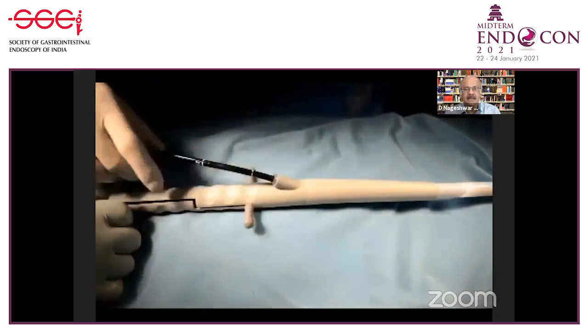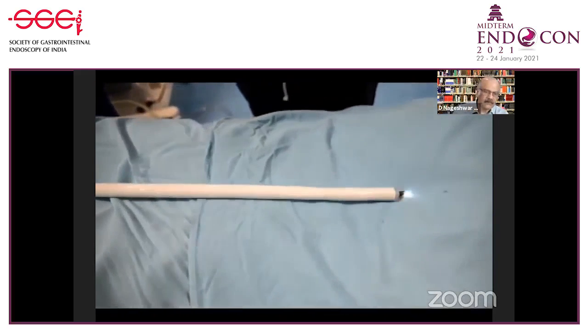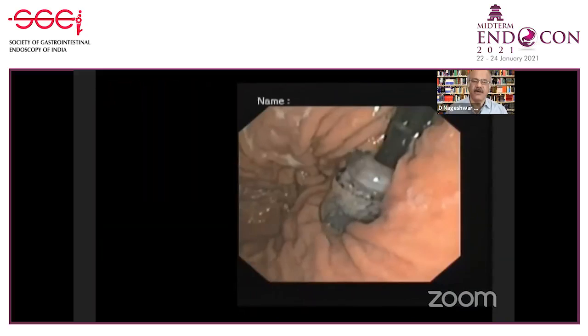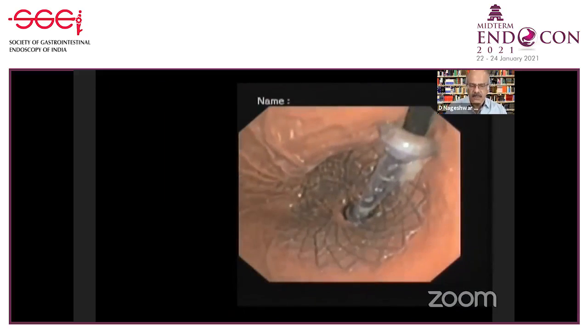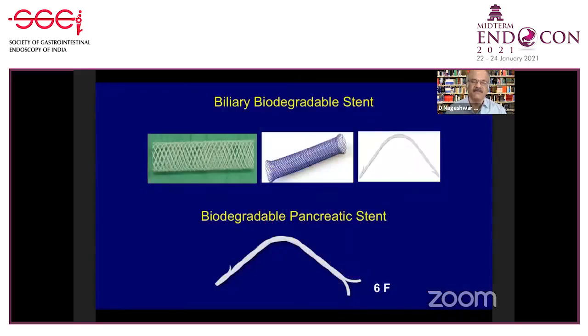Again, this can be done with a pediatric endoscope together with a regular overtube, and you can see this is how we do it. We put this inside, and with the pediatric scope, you can observe how the stent fits in. We just pull it up a little so it fits into the fundus of the stomach, and causes hormonal changes and produces effects. And again, we have a small series of cases. We have shown quite good resolution in diabetes and also in obesity.